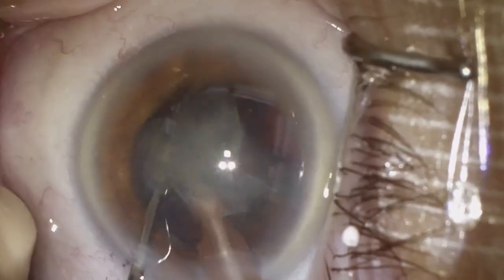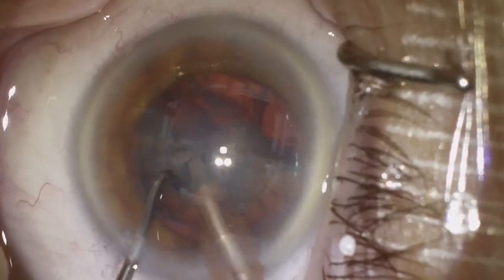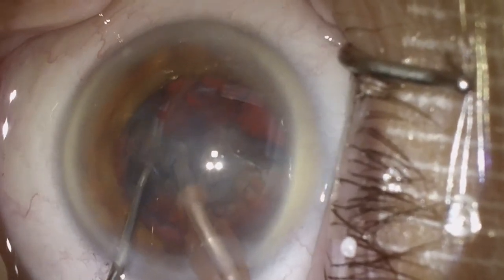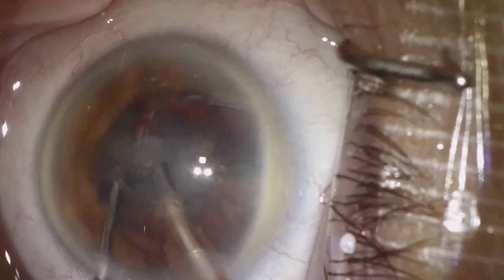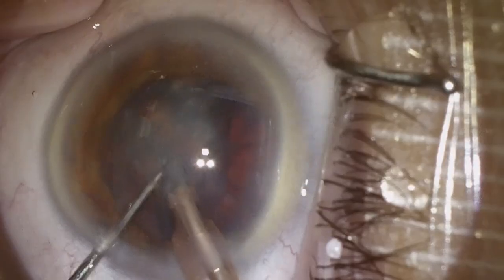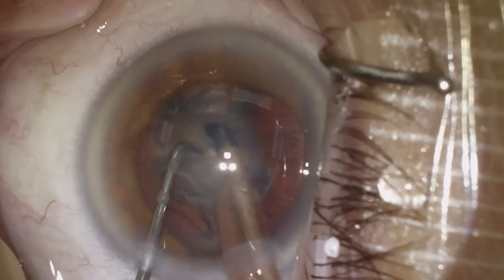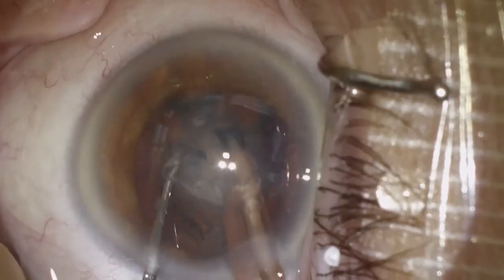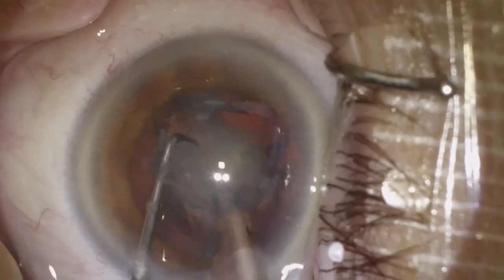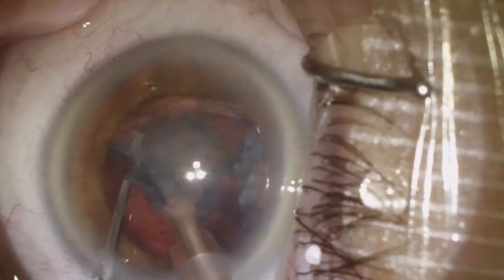Second quadrant, as you can see, I use my chopper to position that quadrant, keeping the phaco probe in the center as much as we possibly can. So I use my second instrument here. I'm going to rotate two quadrants left, one larger than the other. I try to leave the larger quadrant for last, if possible. If not, then we'll take that out. So here we go, one small quadrant removed, and then we'll tackle this larger quadrant here at the very end.